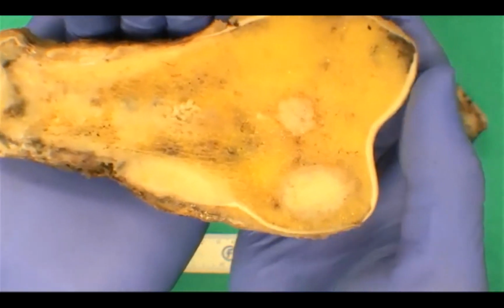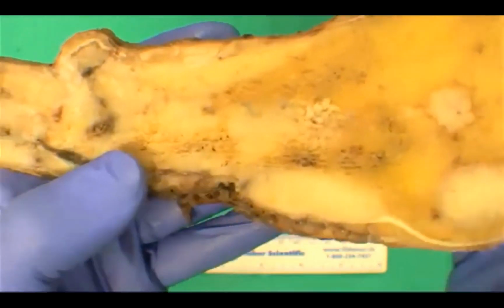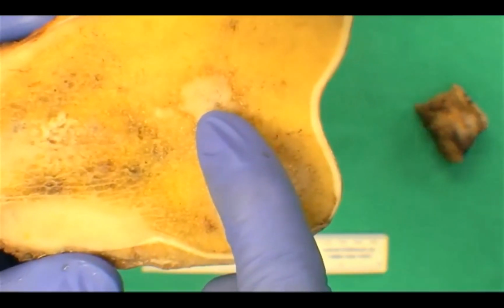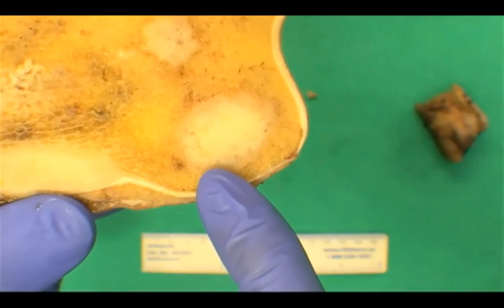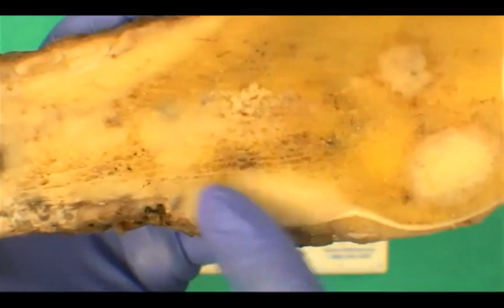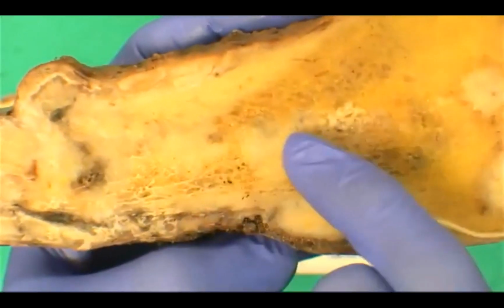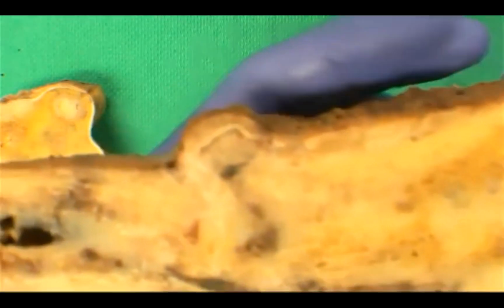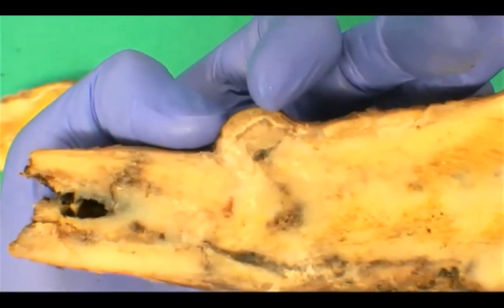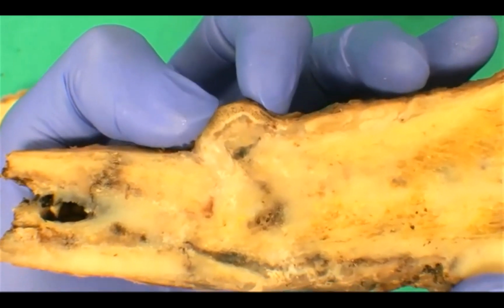It's multifocal. Nice, great. There are some really great descriptors here for the lesion that you're seeing. It is multifocal. There's one spot here, there's another spot here, there's this kind of soft tissue component here, there's some more through the middle. As somebody correctly pointed out, there is a fracture site. And again, there's this soft tissue component here as well that's a little bit calcified.